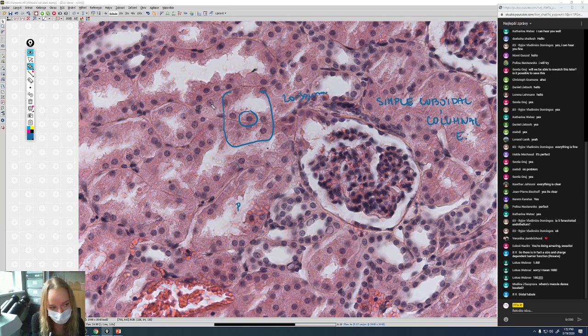And so sometimes when you have a section through the proximal tubule, it's very likely you cut right above the nucleus or under the nucleus. So sometimes you're not able to see nuclei here, but they're there, of course. Each cell has its own nucleus, but you cannot see them.